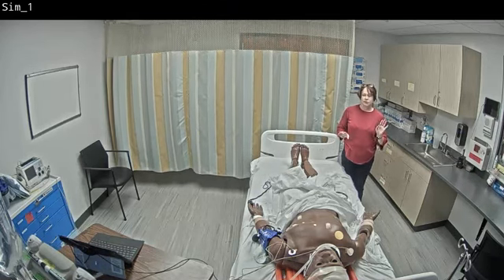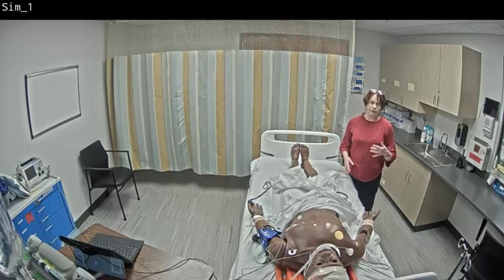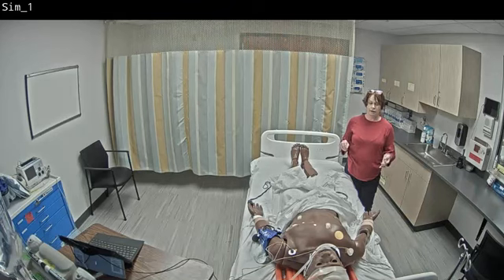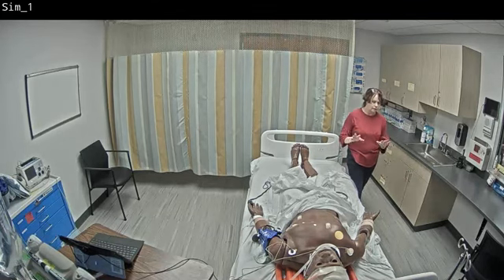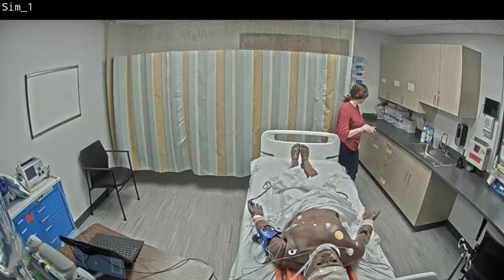This video is going to cover the simulation room and how you utilize it for simulation or for skills lab. It is particularly for intermittent catheter insertions and Foley catheter insertions on one of our male simulators. This is Freddy, one of the simulators we have, and I'll cover what that will look like for you in skills lab or simulation.